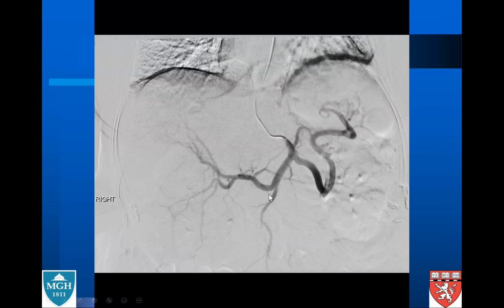That is the right gastric. So the right gastric is coming off the proper hepatic artery, and then we have a normal left hepatic artery, and there may be a middle hepatic artery and right hepatic artery branches. So very typical anatomy. Her liver tumor, you saw, was involving the right and extending to the left. So the plan actually was to treat whole liver radioembolization.